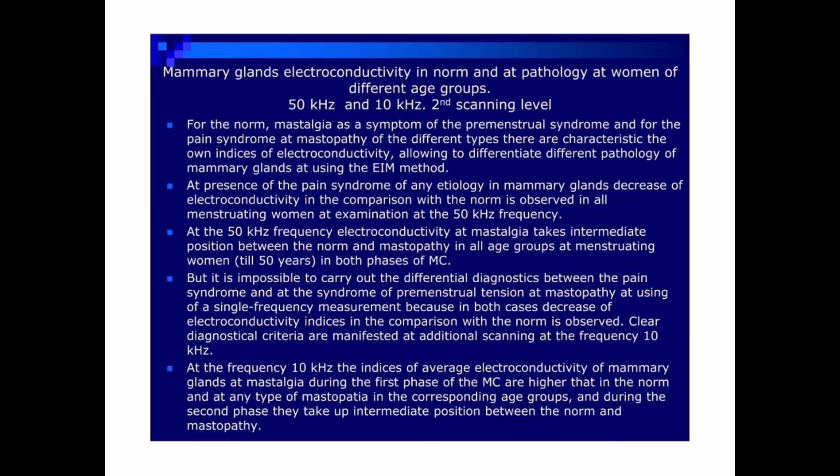At the frequency 10 kHz, the indices of average electroconductivity of mammary glands at mastalgia during the first phase of the MC are higher than in the norm and at any type of mastopathy in the corresponding age groups, and during the second phase, they take up an intermediate position between the norm and mastopathy.